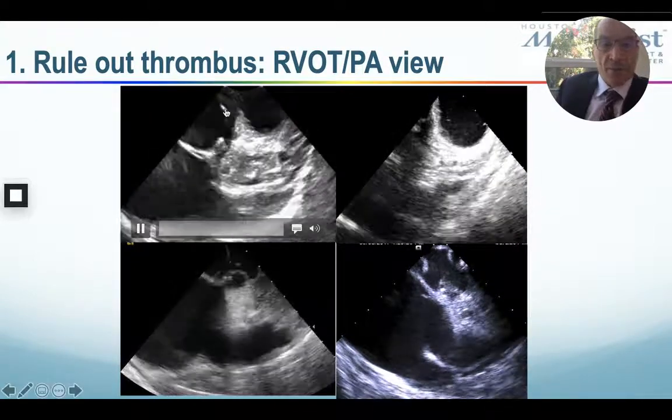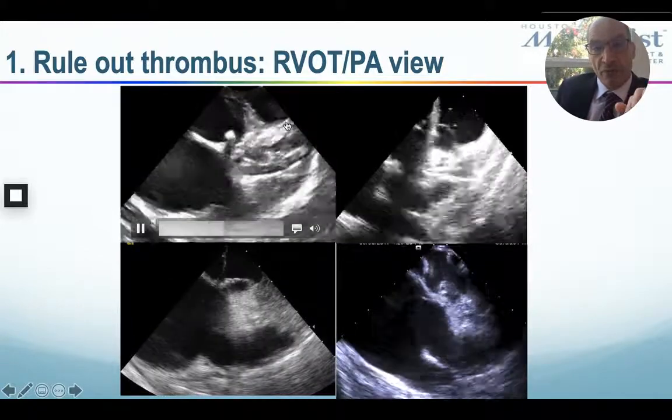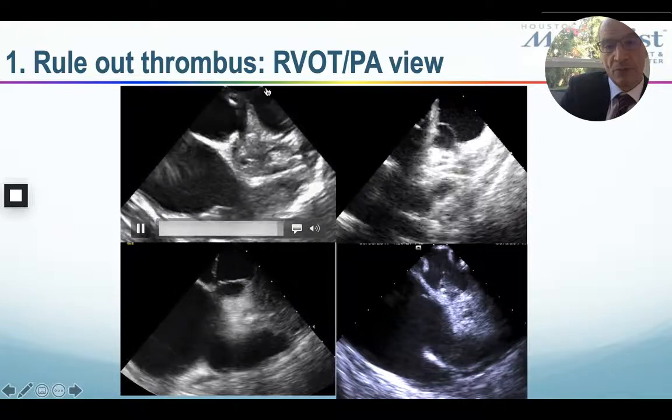From the right atrium, you advance into the right ventricle. That's usually my first screening view. I get into the RVOT, and from the RVOT, you can image the appendage. This is the appendage, looking at it from the RVOT.